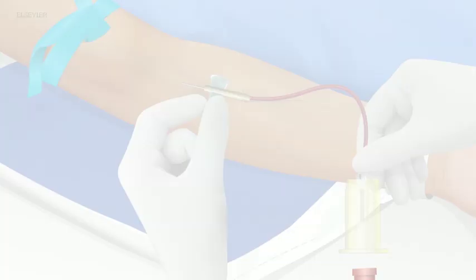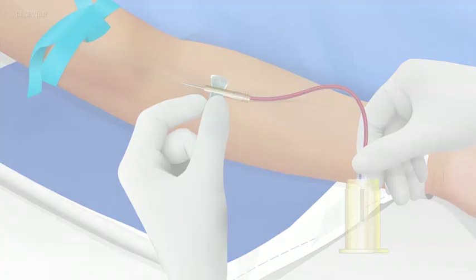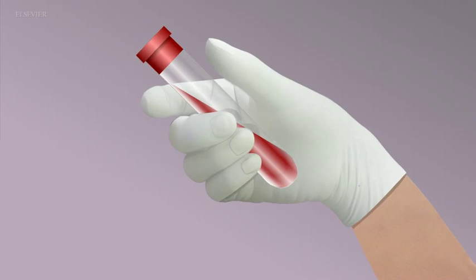If additional blood specimens are required for other laboratory tests, insert additional specimen tubes into the collection barrel and engage the sheathed needle as needed. After tubes that contain additives are filled with blood, gently turn them up and down immediately.